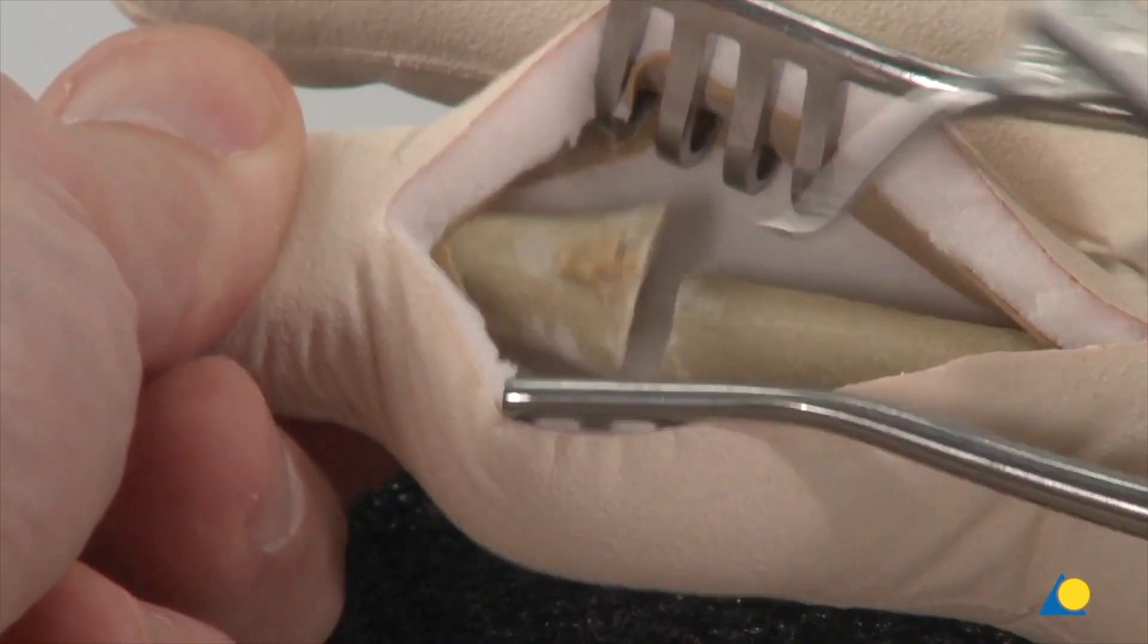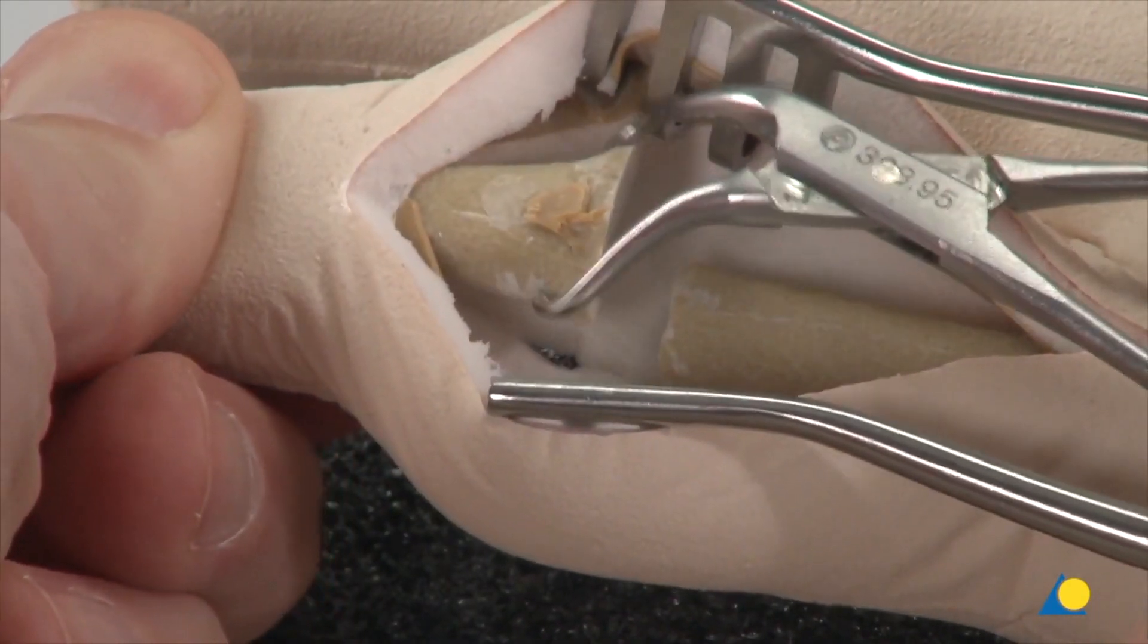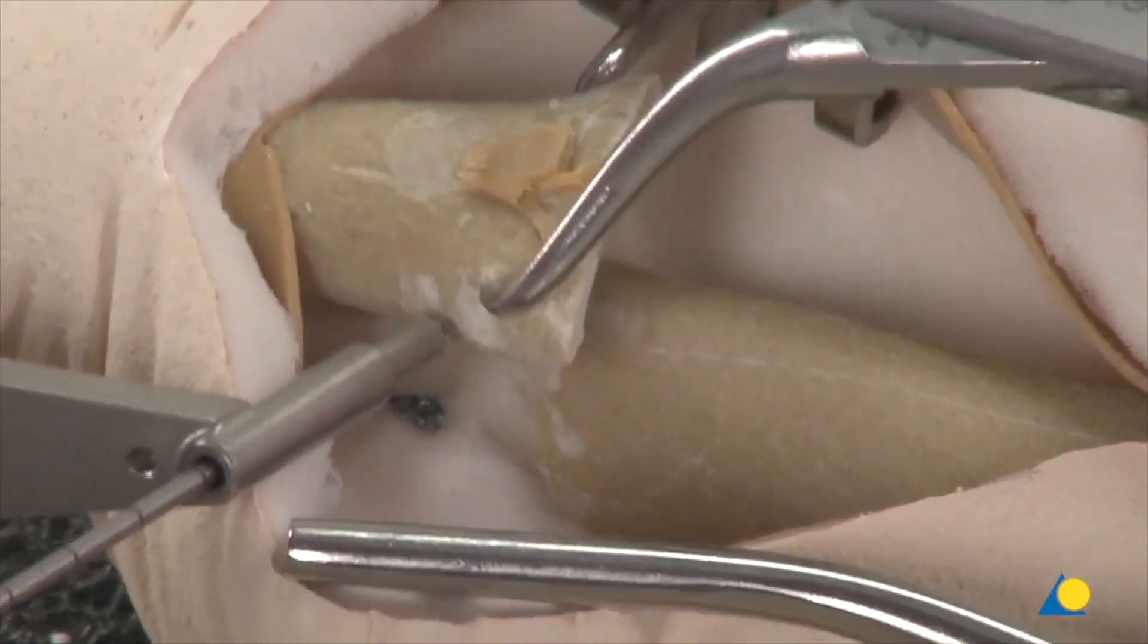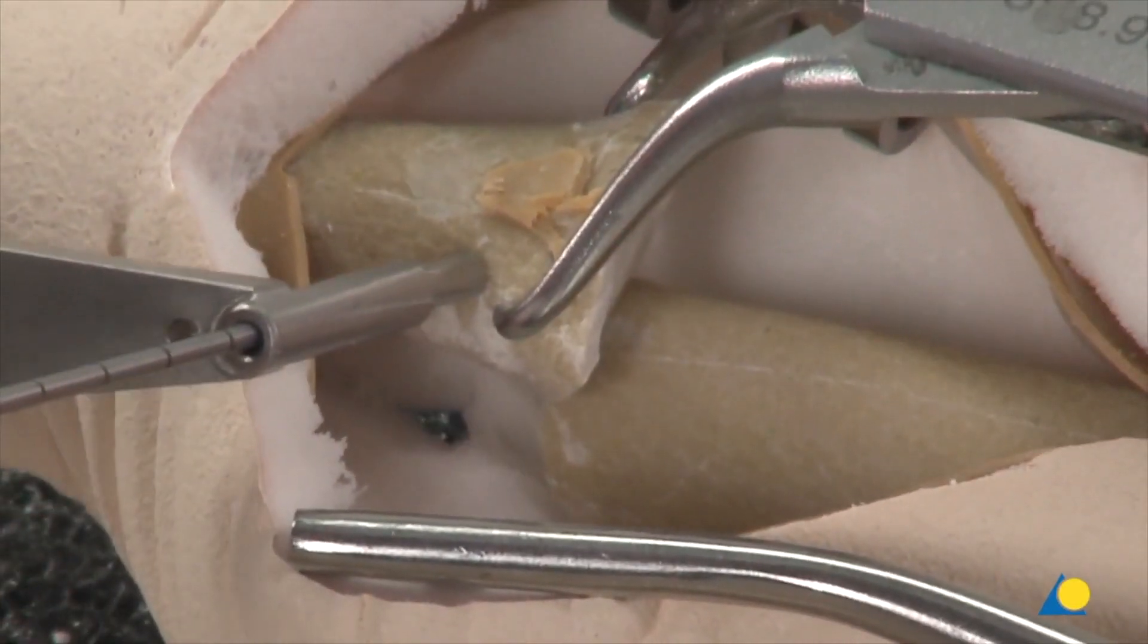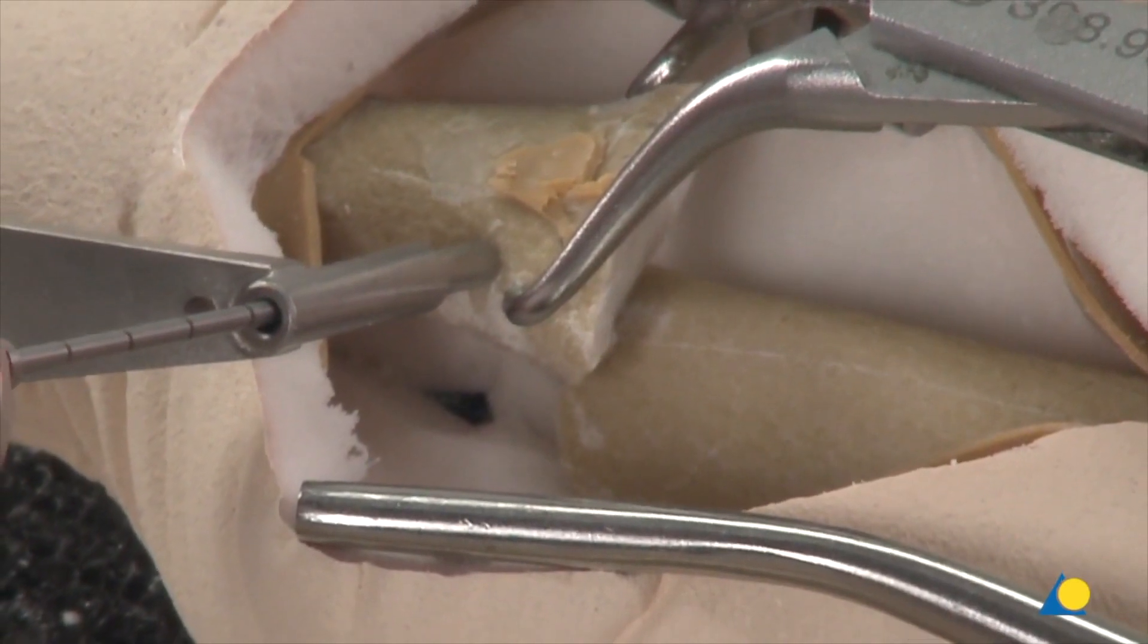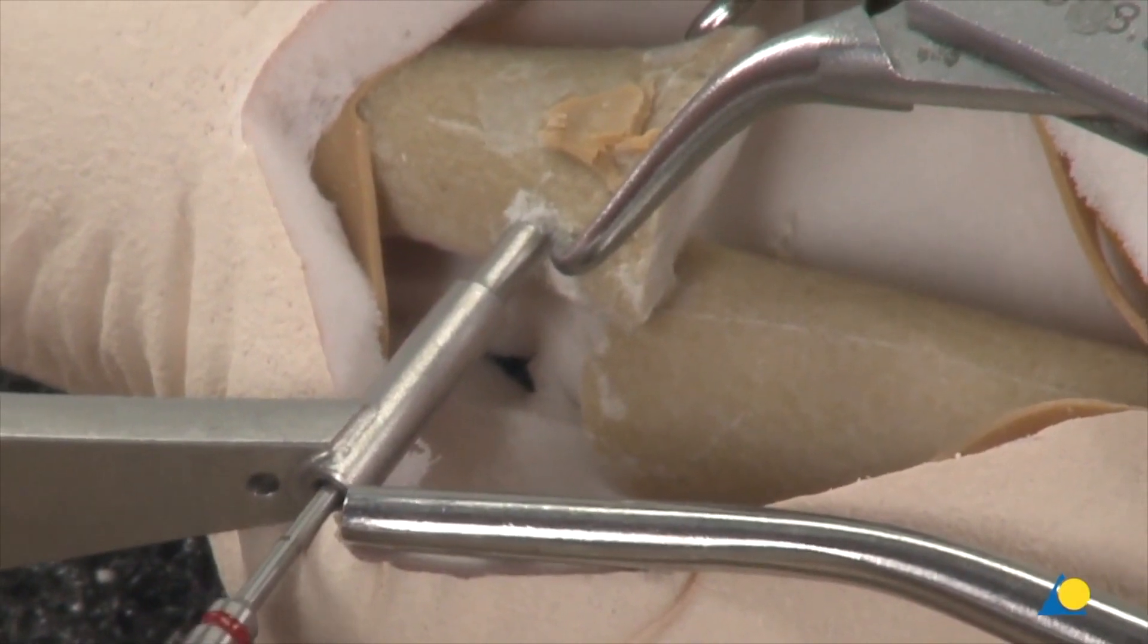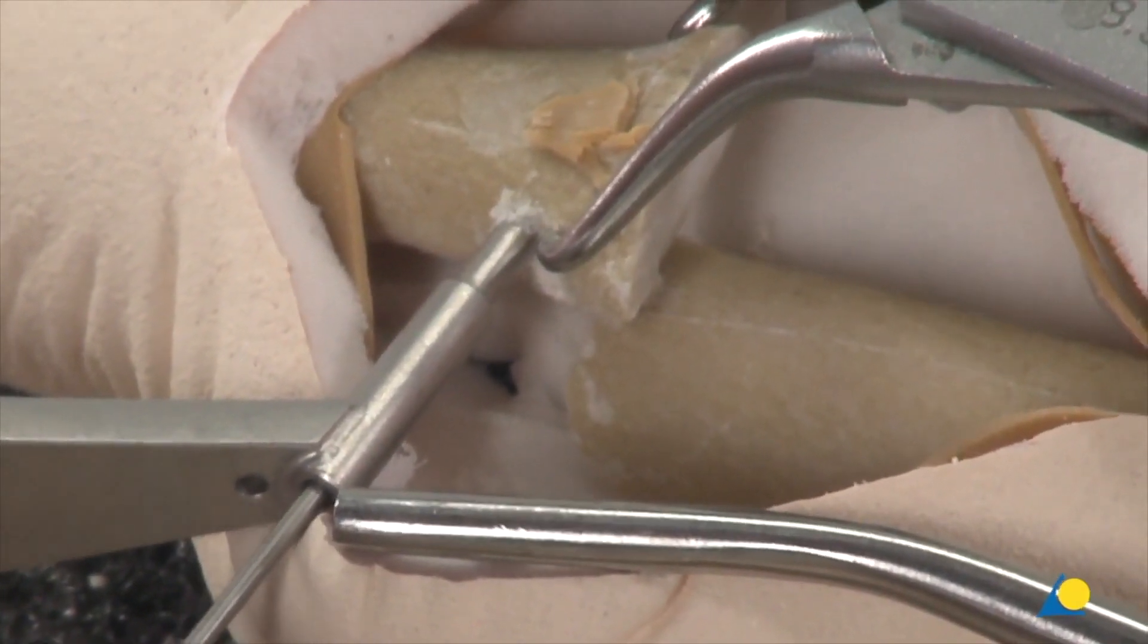The distal fragment is stabilized with a reduction clamp. A transverse channel at least 0.5 centimeters distal to the osteotomy is drilled in the dorsal half of the middle phalanx with the 1.1 millimeter drill bit using the appropriate drill sleeve.